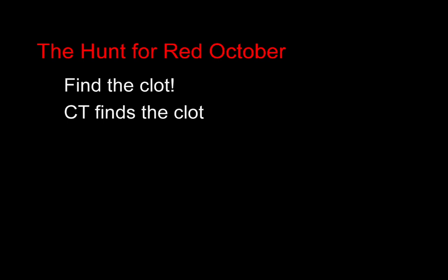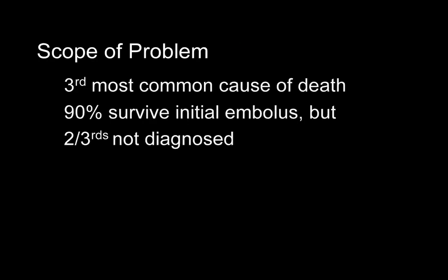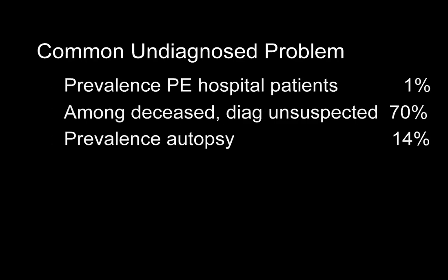CT visualizes the clot and has rapidly emerged as an important clinical tool which will ultimately provide new insights into the natural history of this process. Pulmonary embolus is common and poorly diagnosed. How big is your hospital? 1% of those patients have pulmonary embolus.